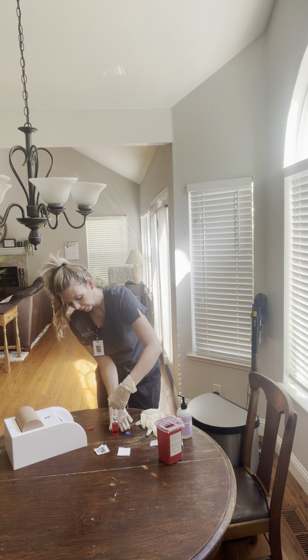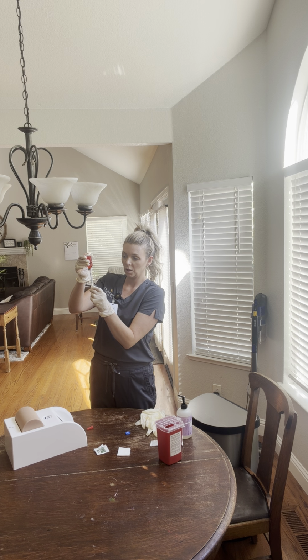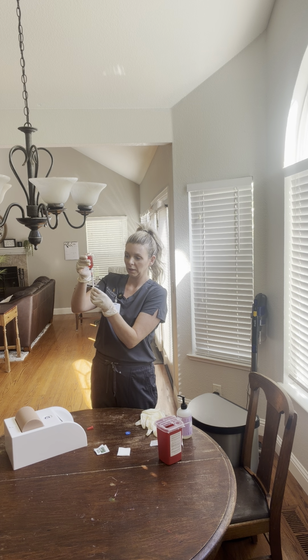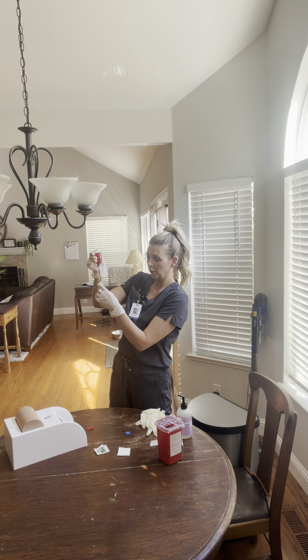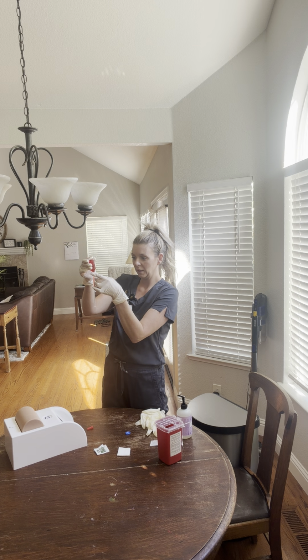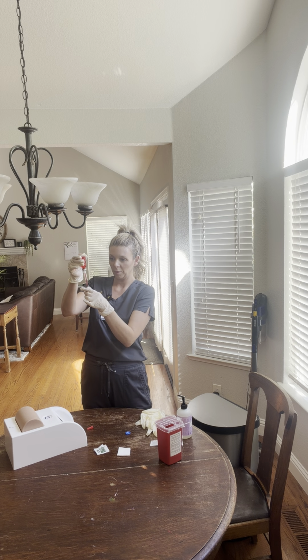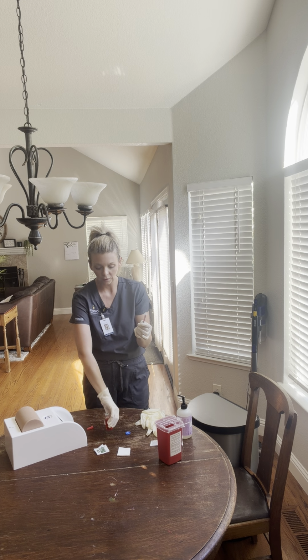I'm going to carefully invert, and I'm going to begin to slowly withdraw 1 milliliter of heparin. And I'm going to be careful not to have any air bubbles. I can go a little bit above the 1 milliliter and just tap my needle and make sure that I have no air bubbles. And I do not have any air bubbles in my syringe, so I'm going to pull my needle out.